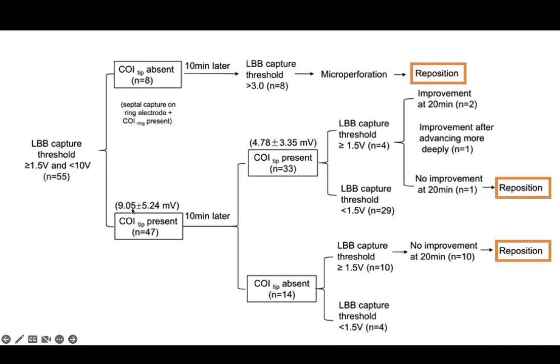If you still have a current of injury present, then they say wait a little bit longer. If the current of injury is still present, then maybe you should advance the lead a little bit more, wait a little bit longer, or if there's really no improvement, then you reposition, although waiting this long is probably not really practical.